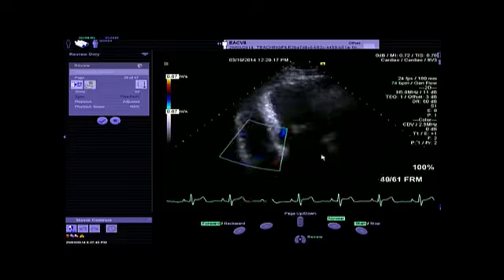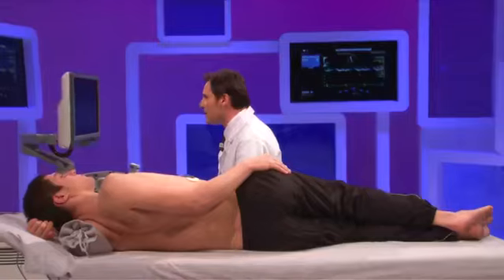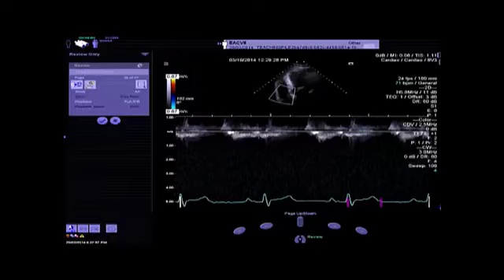And I will try just to measure that if there is any kind, because even if you don't have any color flow, you should try with the Doppler signal to get any regurgitation that you have missed with the color flow to have an idea of the transtricuspid pressure gradient. And clearly in this patient, it's impossible to get this information. So the last thing to do is to measure the tricuspid annulus diameter, and we will do this.